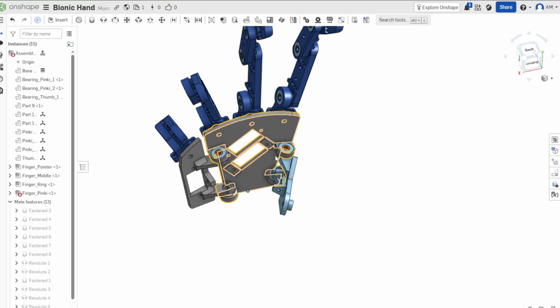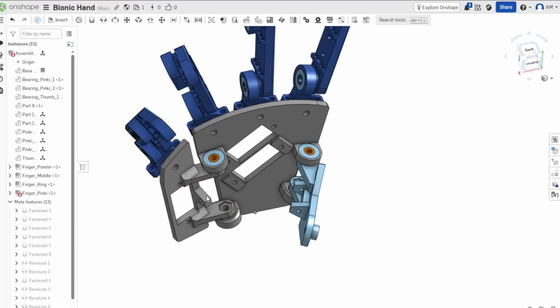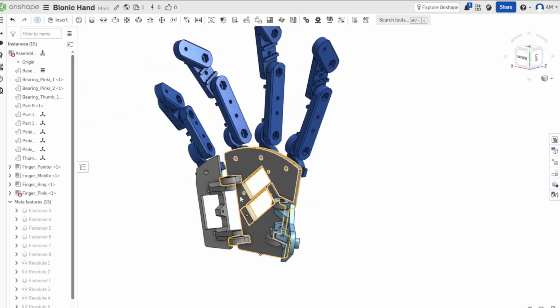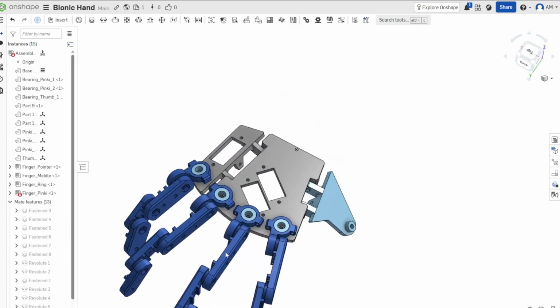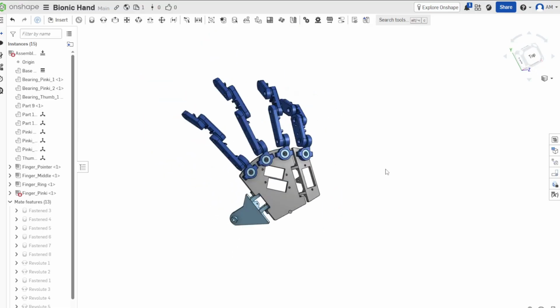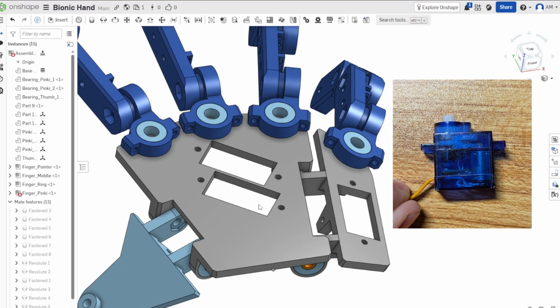You'll notice your actual hand, well, it can bend right down the middle. And so if you grab, say, a ball or a rounded object, having that opposability to be able to grab it seems quite important for more lifelikeliness and more dexterity. So I'm still working out all the placements here, but these are the little blue servos that everybody sees everywhere.